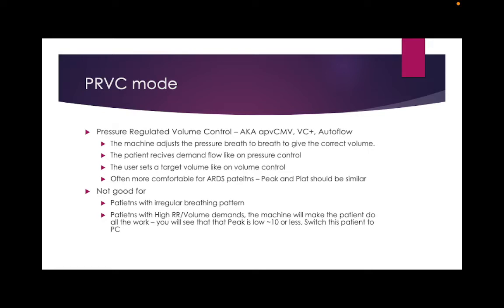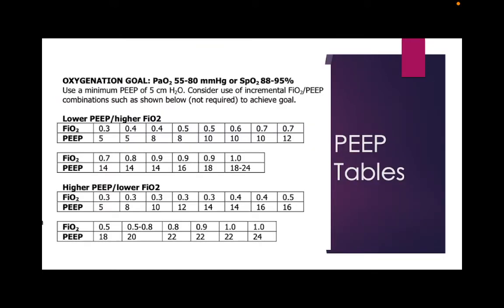Okay, so the next chart on here, on this ARDSNet card, talks about PEEP. What is PEEP? What does PEEP stand for? Positive end-expiratory pressure.